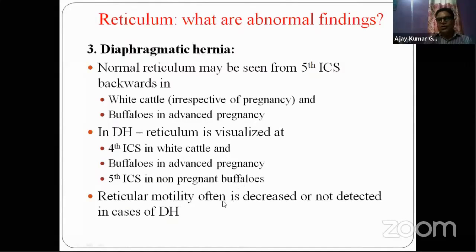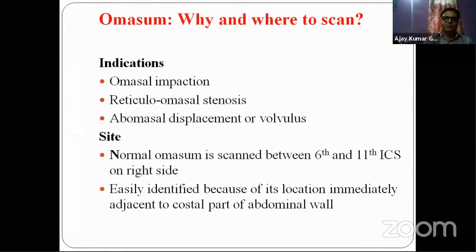The reticular motility is often decreased or not detected in case of diaphragmatic hernia, because there will be adhesions between the diaphragm, between the abdominal wall and reticulum. So the motility either is not detected or will be decreased.